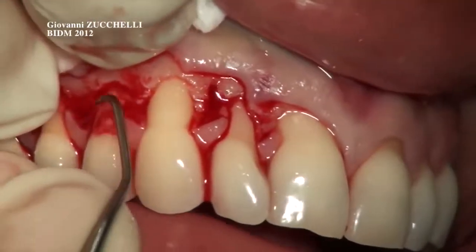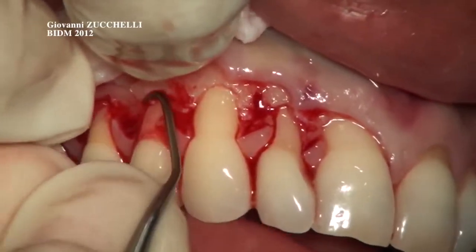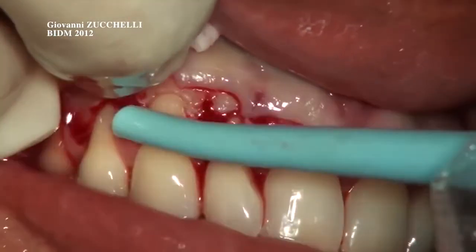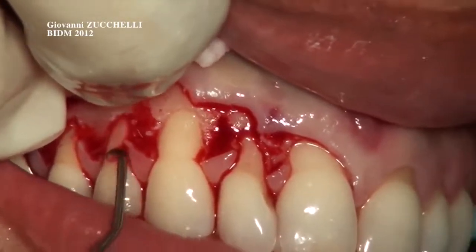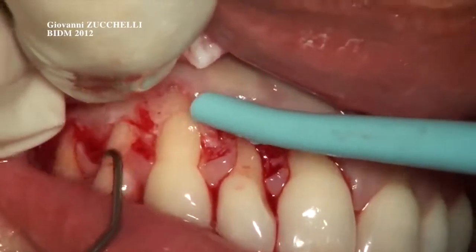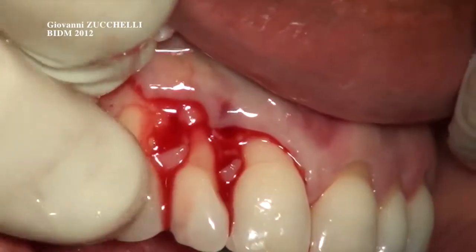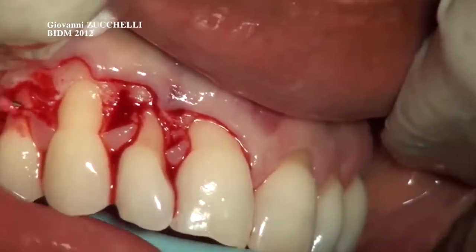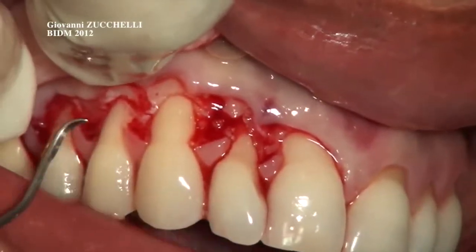Okay. And make root planing. A lot of saline is necessary, not too much, to maintain the roots clean, and at the same time not to accumulate too much smear layer inside the dentin tubuli. Obviously, please suction. Obviously. That's enough.